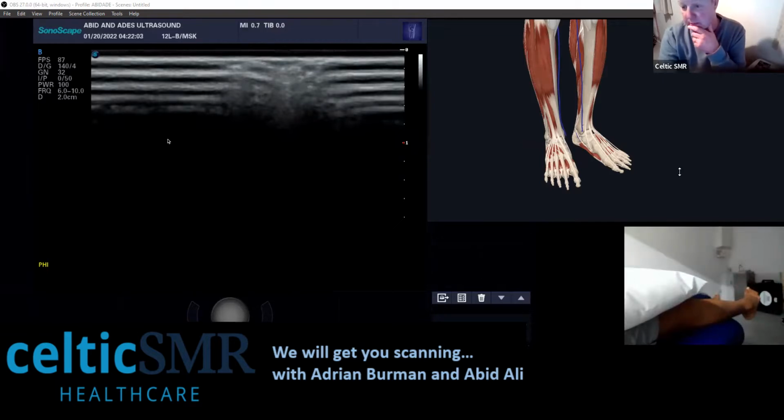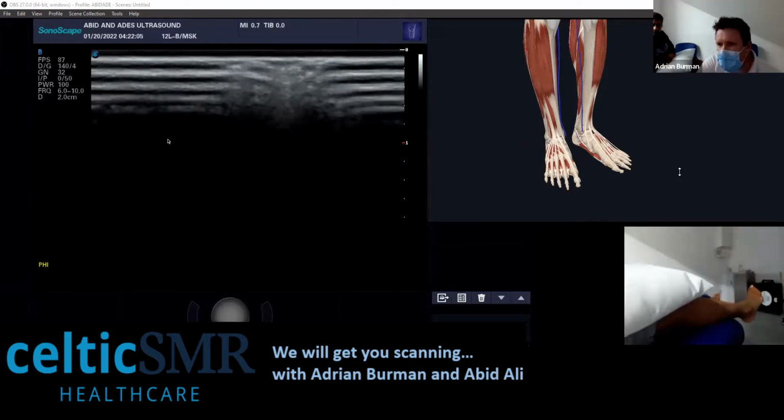Do you use the chroma setting to help visualize different ligament structures? I don't for ligaments, but the chroma setting is really good to use on many different things. I tend to use it on meniscus. That's quite nice to see little meniscal clefts. I use it a lot in gynecology.